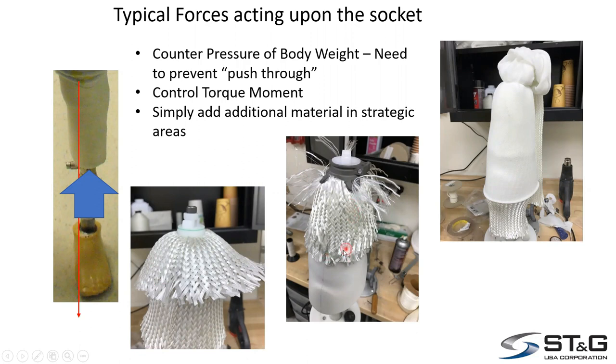If you really unwind the braid, you'll get long fingers from the braid. These fingers will blend in really well and you won't even see the transition. If you look here, you can see how it's really hairy. I took some of the braid material and ran it through the holes. I just let it lay loose so that it helps to tie in the component. Then, when you're ready to do your layers over the socket adapter, again, you can stagger the material, tie it in, and have it running up.